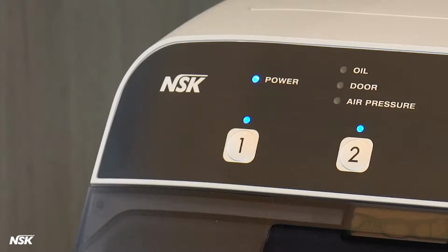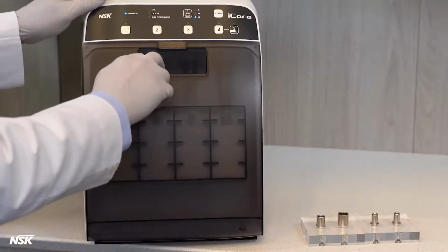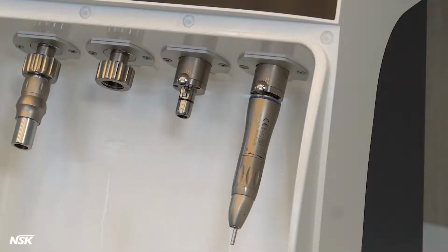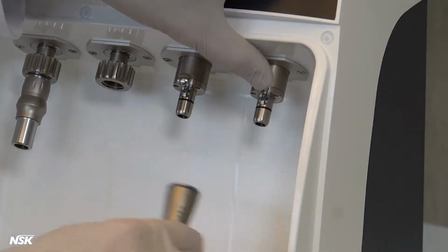When lubrication of all connected and activated ports are complete, you will hear a long beep, and all lights will turn off. It is now safe to open the front door, take out the handpieces, and prepare for bagging and autoclaving. For E-type handpieces, press the lock button with one hand and pull the handpiece with the other.